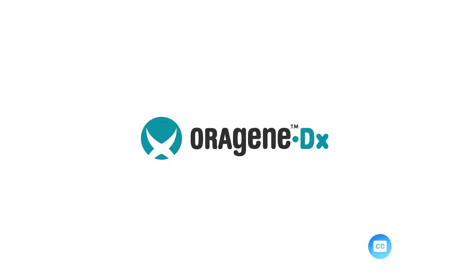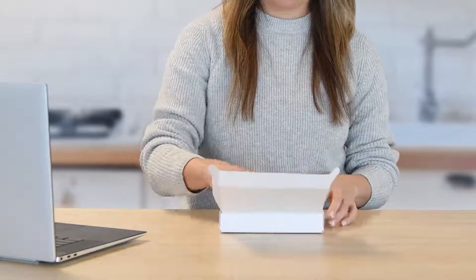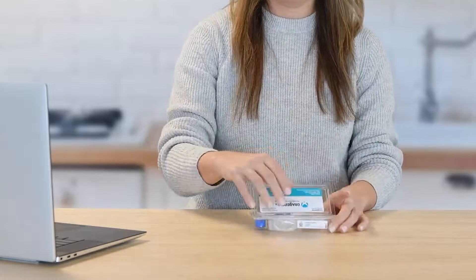The Oragene Dx device is an in vitro diagnostic device and is US FDA cleared for prescription use and over-the-counter or DTC use. The Oragene Dx collection kit provides the materials and instructions for the collection, stabilization, and transportation of human DNA from oral samples.